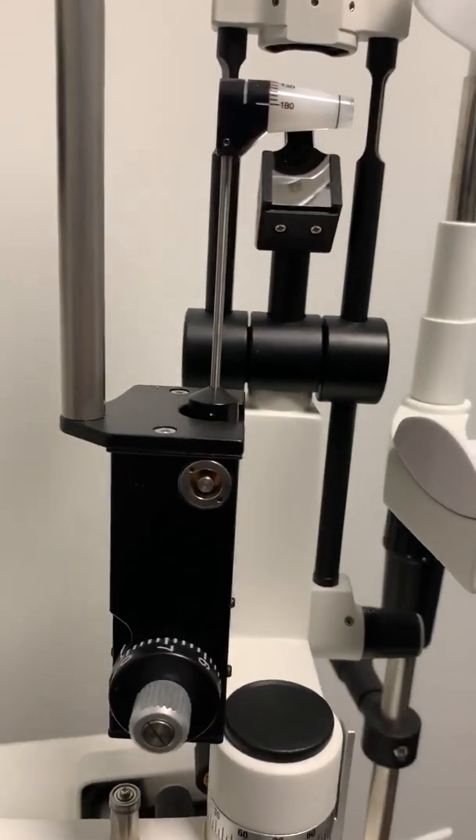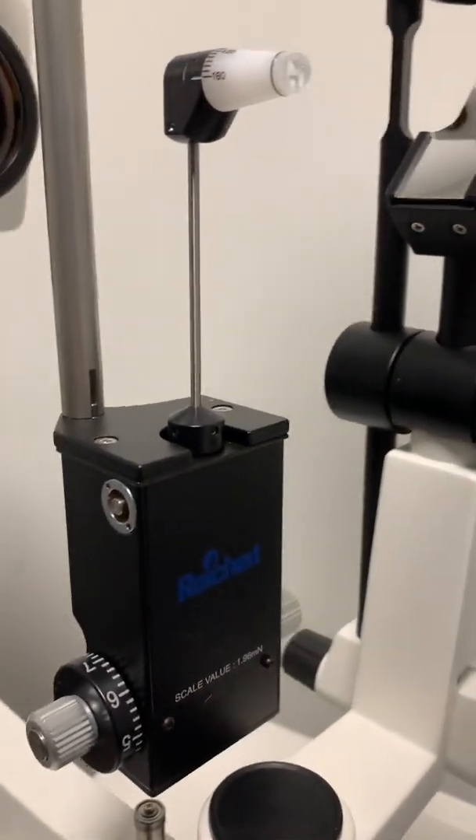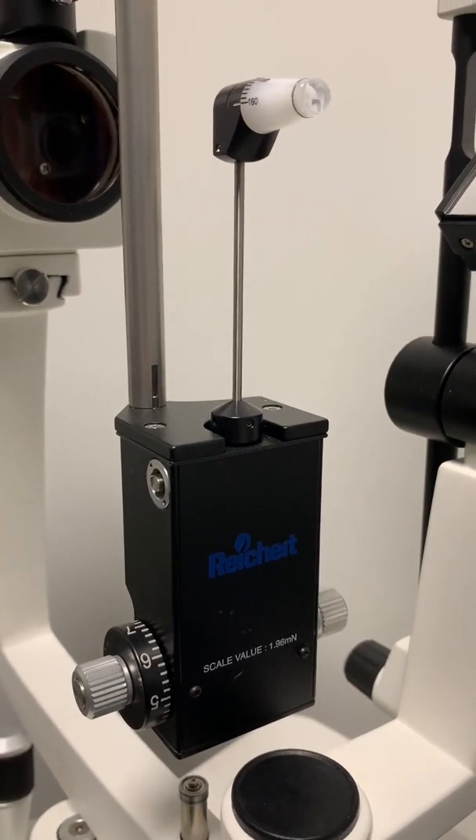There are a couple other ways that we check intraocular pressure, one of which is called a Goldman tonometer. That's a little piece that we use on our slit lamp. With a numbing agent, we can actually press the probe against the eye to check the intraocular pressure. It's a little bit more accurate, but also a little bit more invasive, which is why we normally just put people through the puff of air.